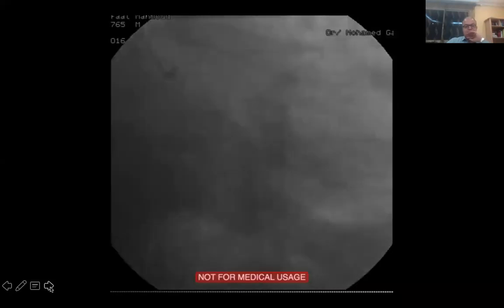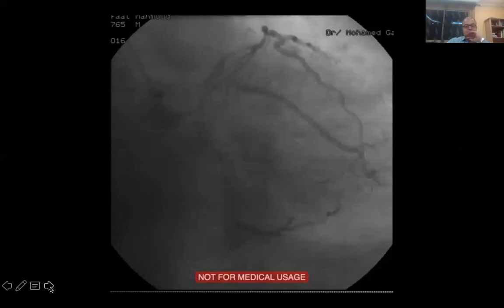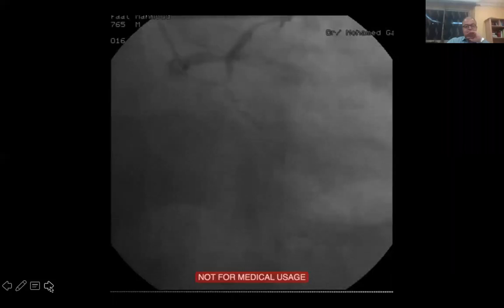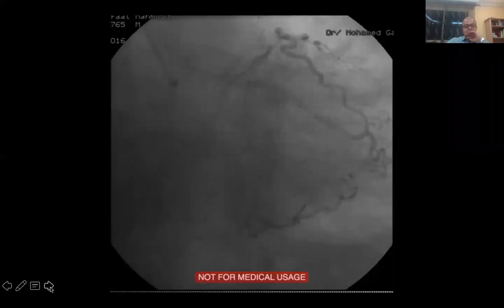I start from the last question. There is no guarantee in the guidelines for provisional stenting to end with the kissing. If you have TIMI 3 flow, you have no pinching. You don't have to do kissing balloon at the end. That is number one. This is number two.